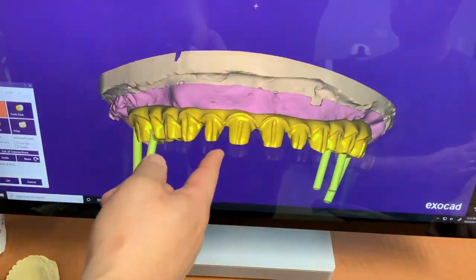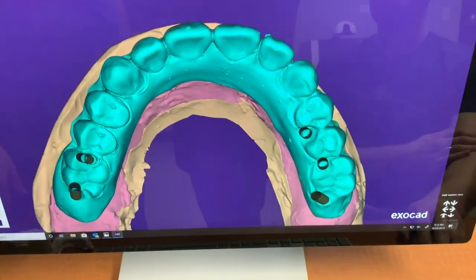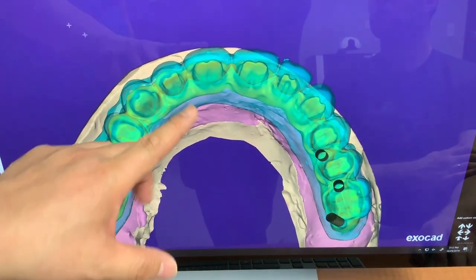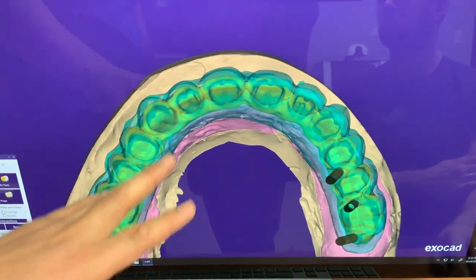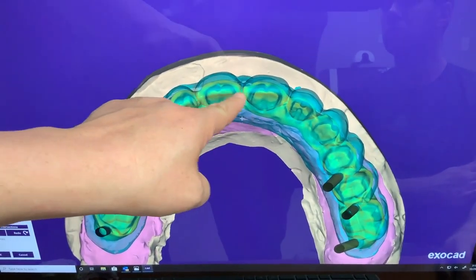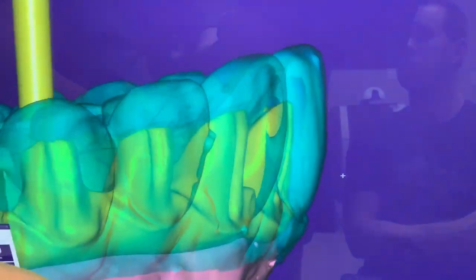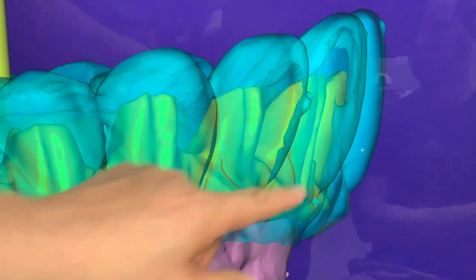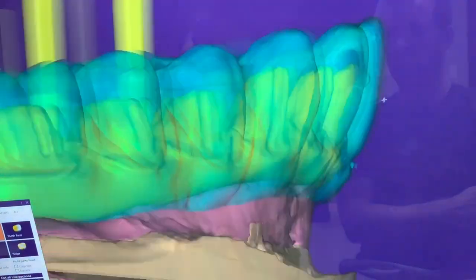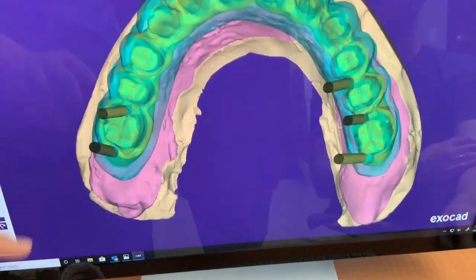We have the final contour. I said it's a little bit bulkier, so we prepped it more — about four to five millimeters of facial room — which is not that much facial. So we'll get a little bit less and bring it in.